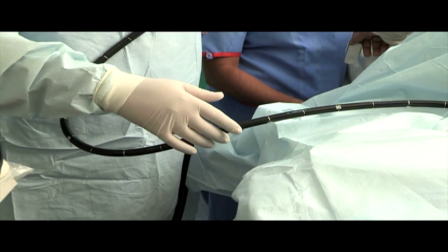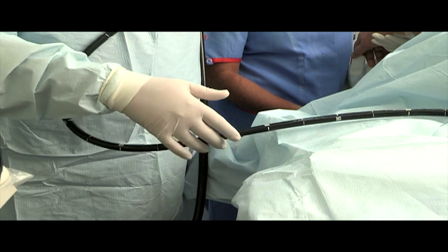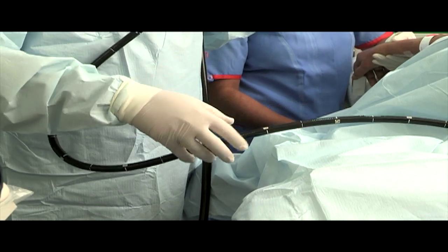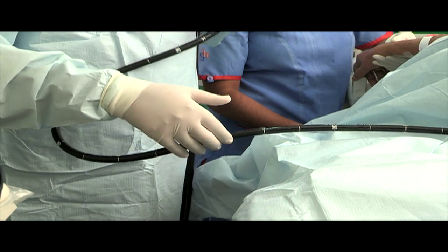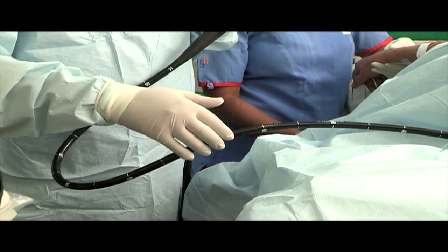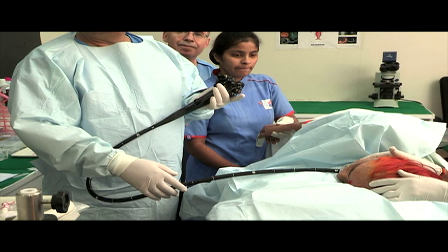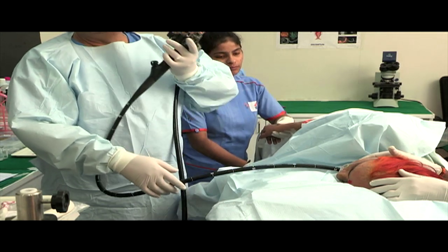Here you can see how the shaft is being handled. The fingers of the right hand gently push the scope sideways and are used as a fulcrum so that the shaft can rotate over them. It is much like how you use your fingers to play the guitar — soft and gentle.